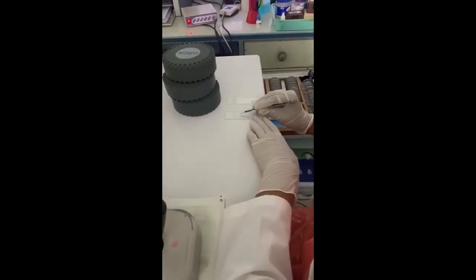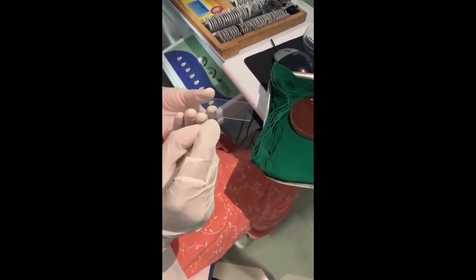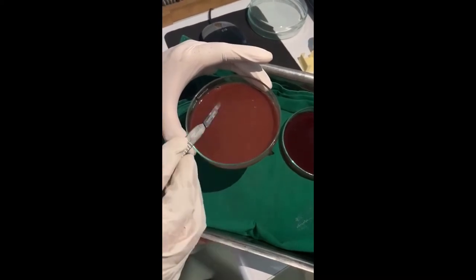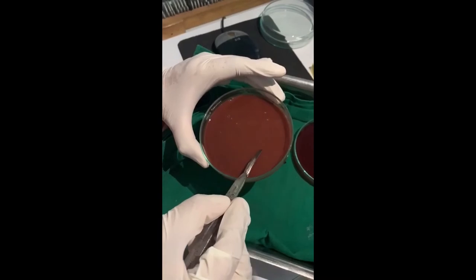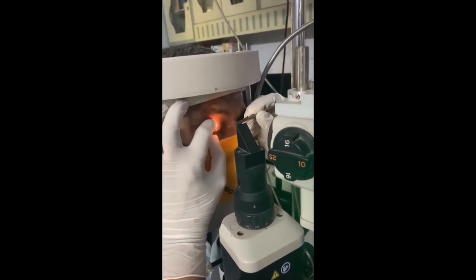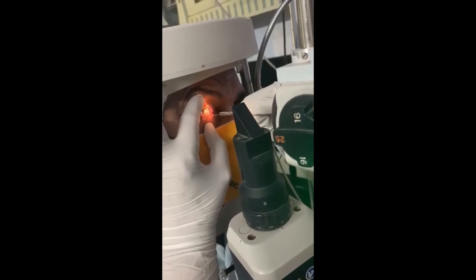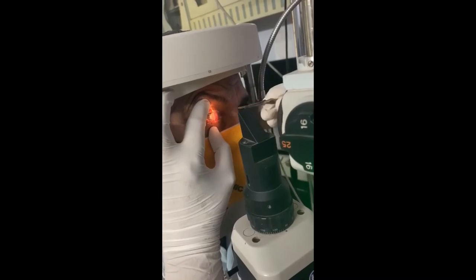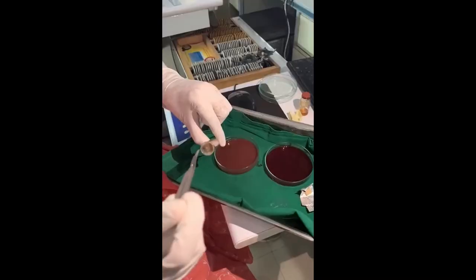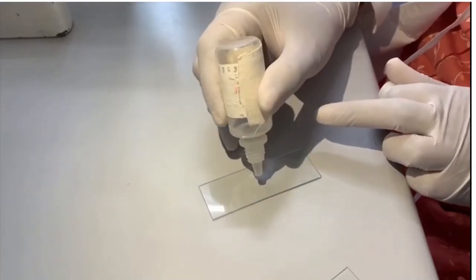For the fungal sample, tap it onto the glass slide. Prepare a smear for Gram stain and inoculate onto blood agar. Change the blade, then take more sample from the eye and inoculate into blood agar and Sabouraud's dextrose agar for identification of fungus.